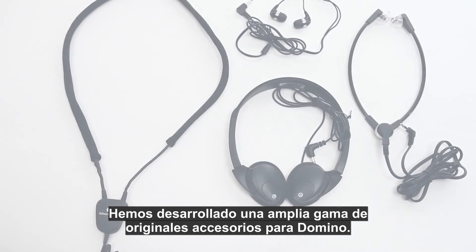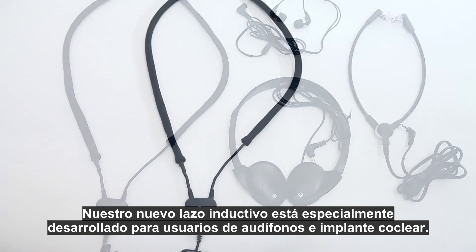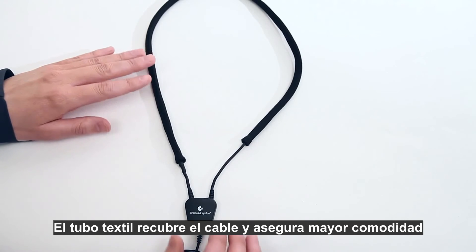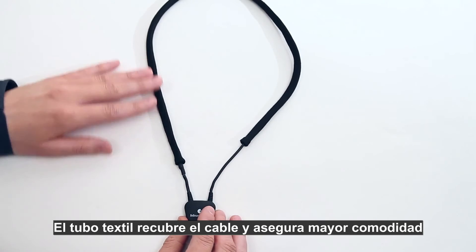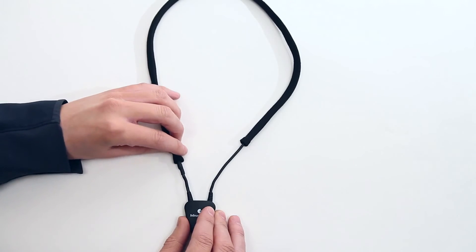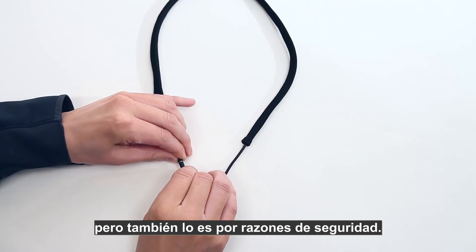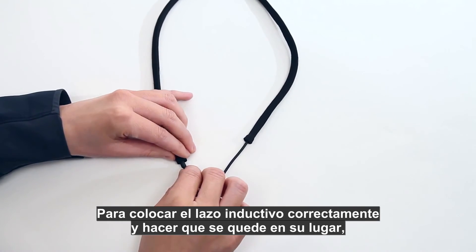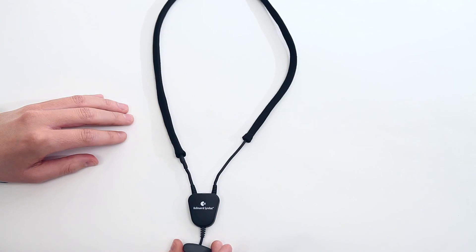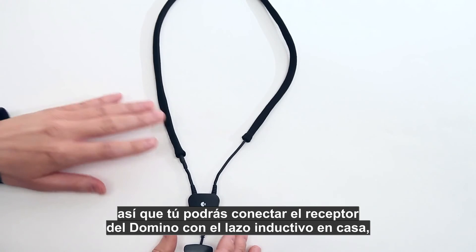A wide range of original accessories has been developed for the Domino system. A new powerful neck loop has been especially developed for hearing aid users — the included textile tube covers the cable and gives additional comfort when wearing the neck loop over clothing or directly against the skin. The loop cable can be separated to make it easier to put on, and for safety reasons a clothing clip is provided to position the neck loop correctly and keep it in place.